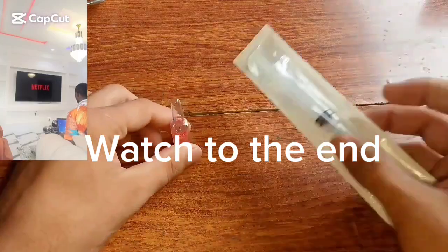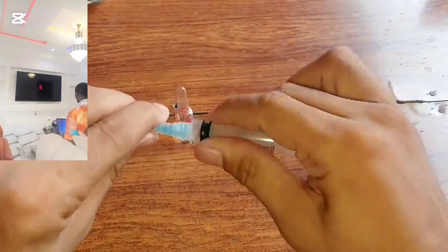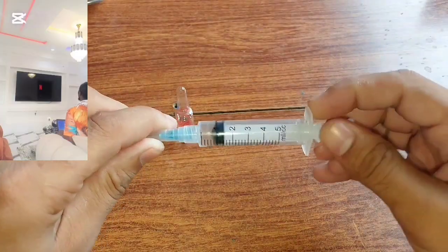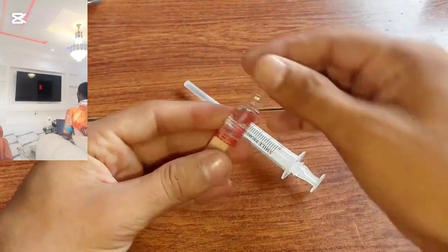In this video I'm going to show you how to give an intramuscular injection. You assemble your syringe and ampoule bottle, but before then you want to check if they have expired. Check if the syringe has expired, and check the injection you want to administer in the ampoule bottle.